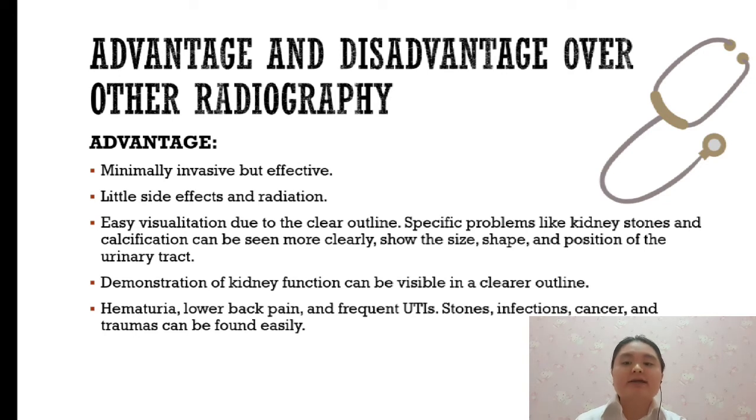Now I will explain the advantages of IVP compared to other diagnostic methods. First, it is minimally invasive but also effective. Second, it has few side effects and little radiation. Third, it is easy to visualize due to the clear outline.